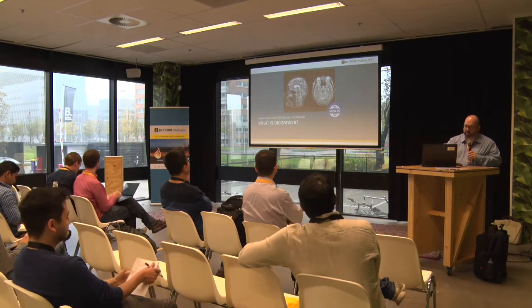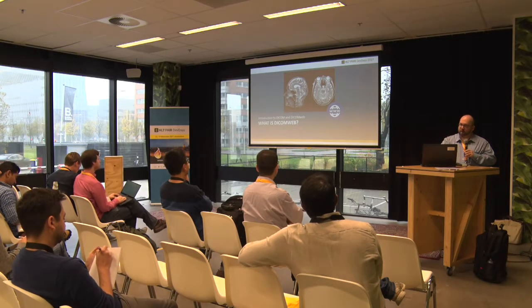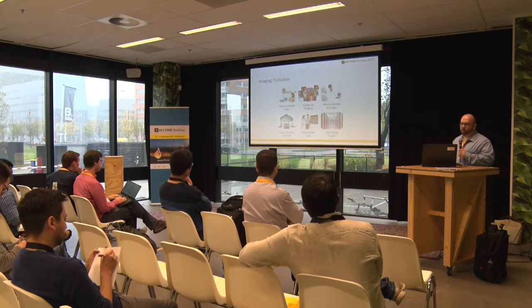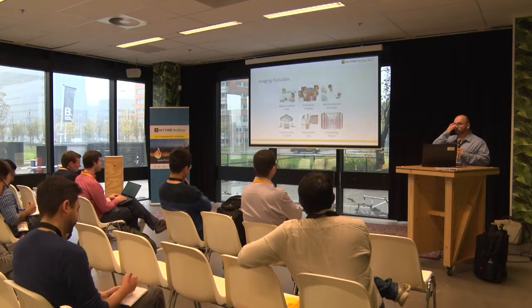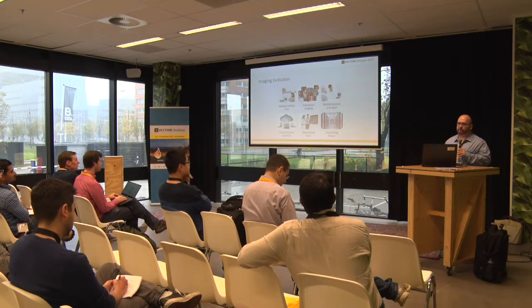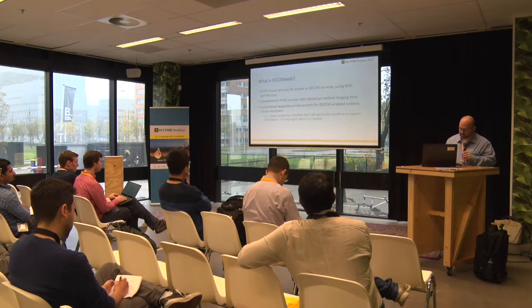So now I'll talk a little bit about DICOM Web. This is comparable to FHIR. It's the RESTful equivalent to DICOM. When we look at some of the evolving use cases, we look at more of this idea of patient-centered care or enterprise imaging. We want to use mobile devices. We want to use cloud services. We really need to embrace the web. This is not something that we can do on the classic DICOM protocols. We actually had to leverage the web to do this.